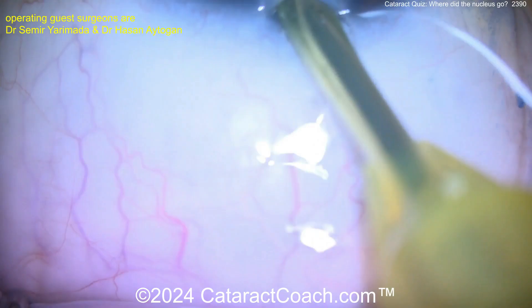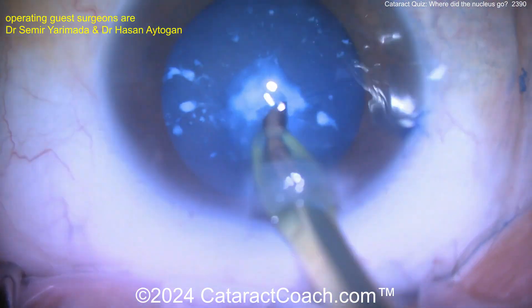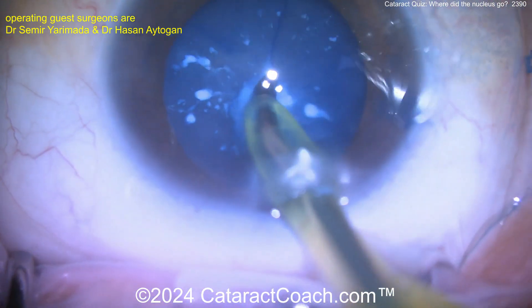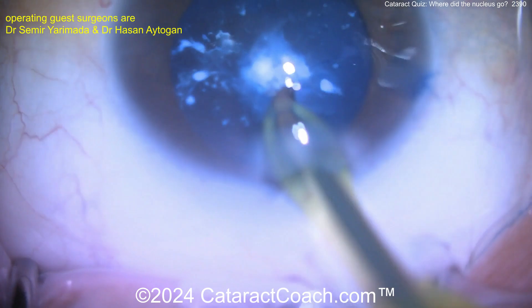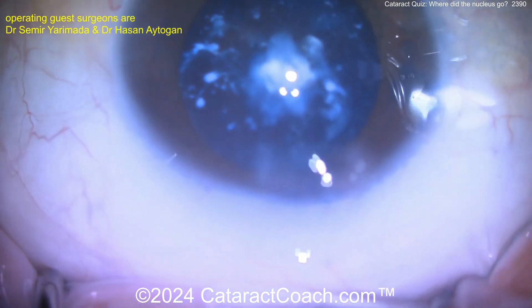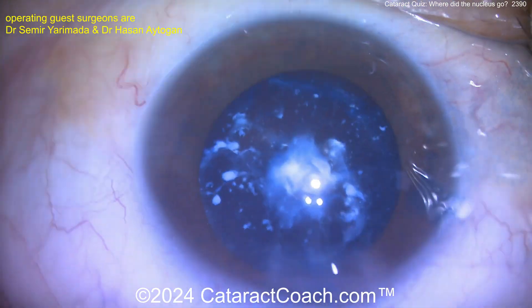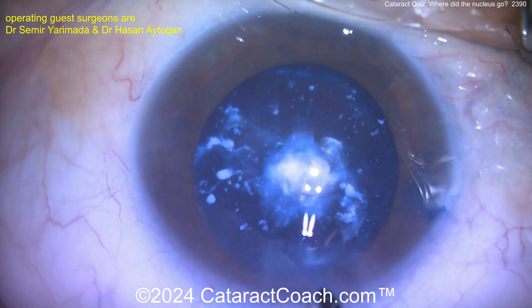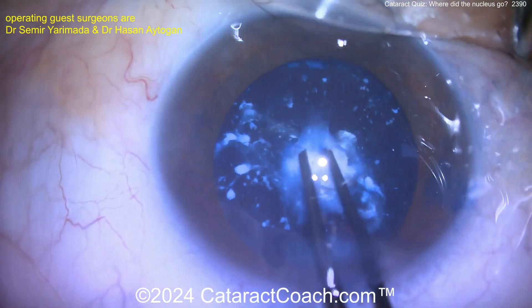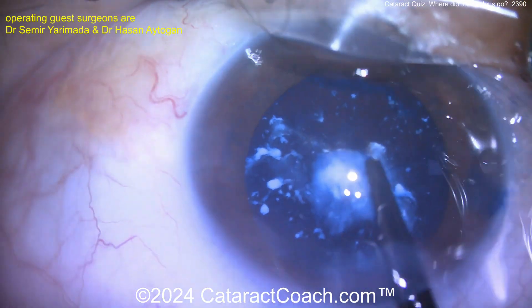Maybe buzzing on the phaco probe — what can you do to get into this? Look at the laxity of the zonular support, how the capsule comes in there. Now, where's the nucleus? You've aspirated out the liquid from the bag. Now you have an opening — you're getting somewhat of a rhexis done, opening it up.